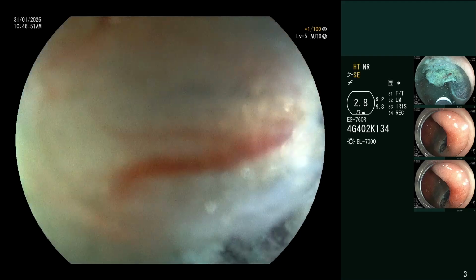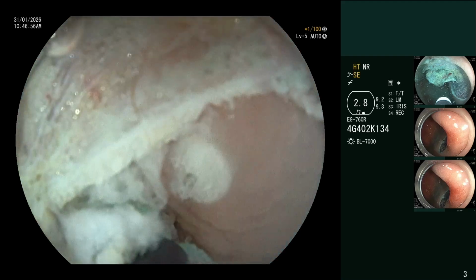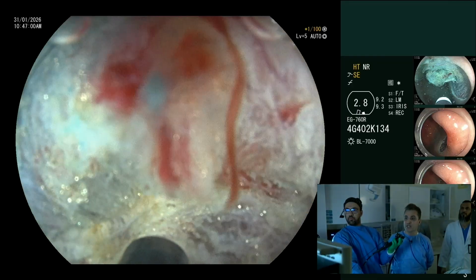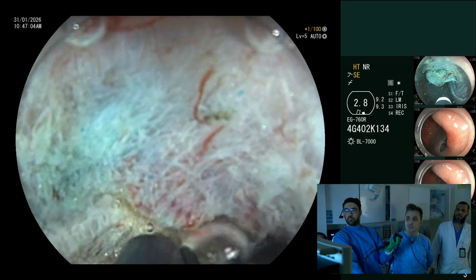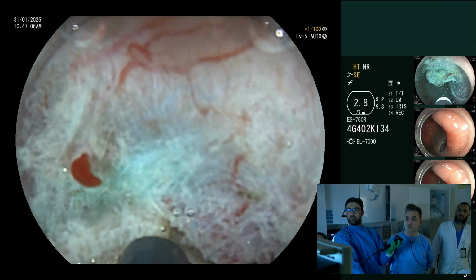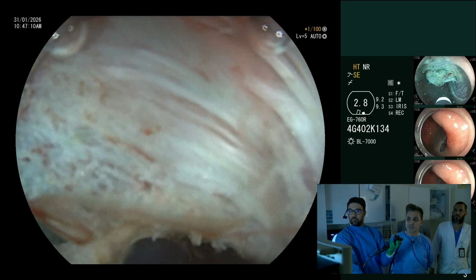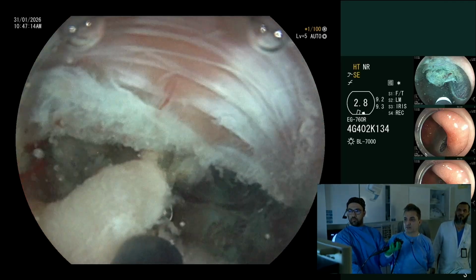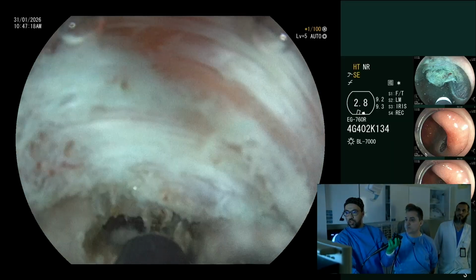This is the final cut-off of the specimen. Yes, you see only this small area is left. We are using the IT nano because this is an isolated tip, so it's not necessary to see the proximal end of the knife. It will be very safe. Only cut the left side of the lesion. And we suspect curative resection, I hope. Inshallah.